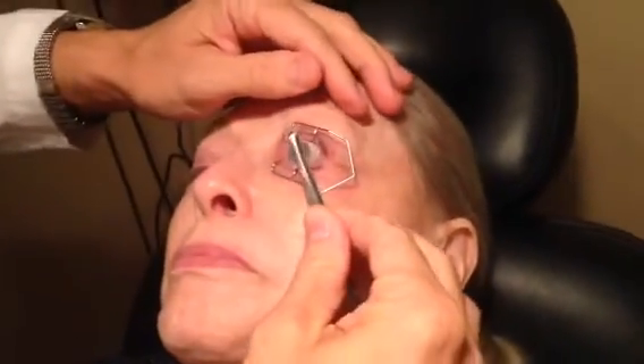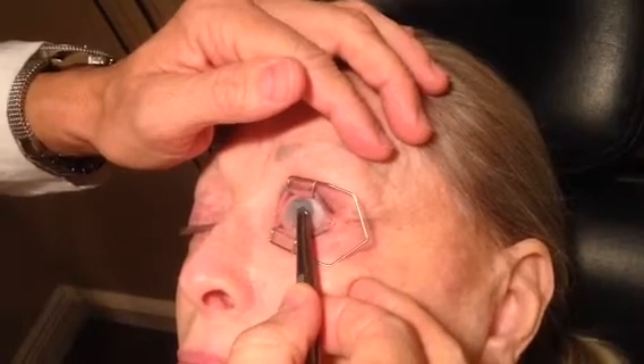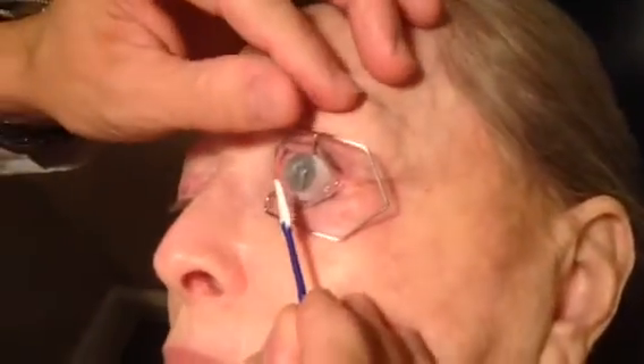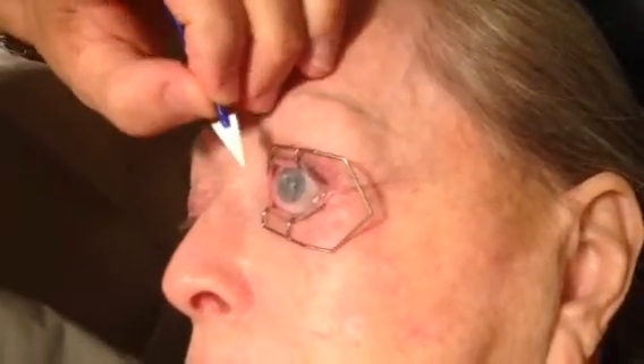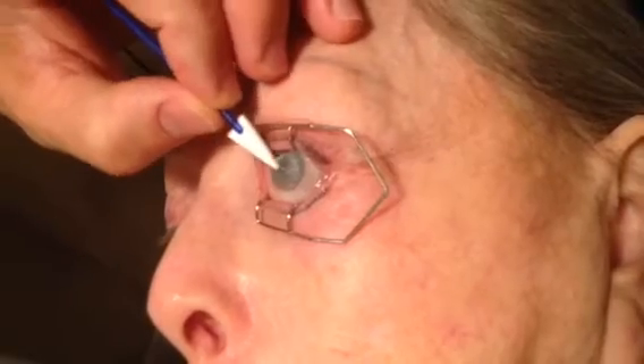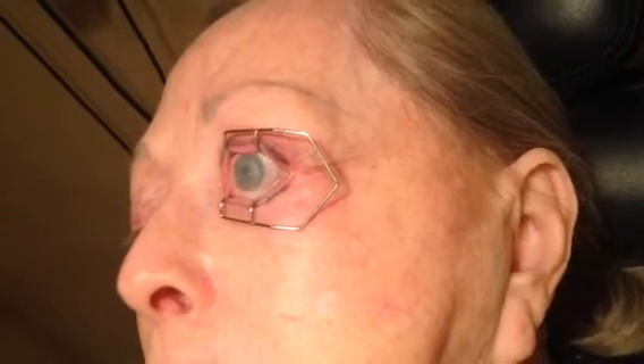Okay, I'm going to put this little membrane on you. You're doing wonderful. It's going to go right over top. Perfect. It's down right where I want it. Hang on. You're doing great. Good job, Alan. Perfect. Perfect. A little bubble's fine, not a big deal. Here comes the image lens. And then after we put this on, we'll take that speculum out. Carefully and slowly.